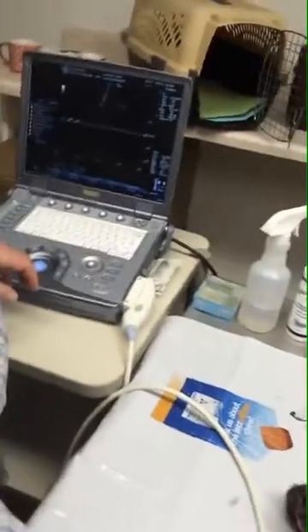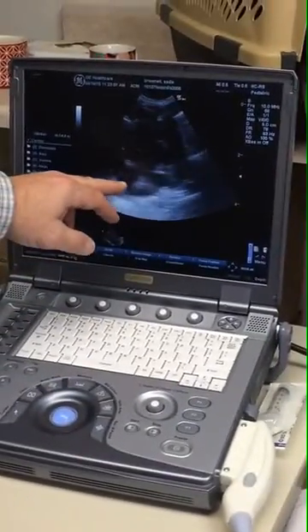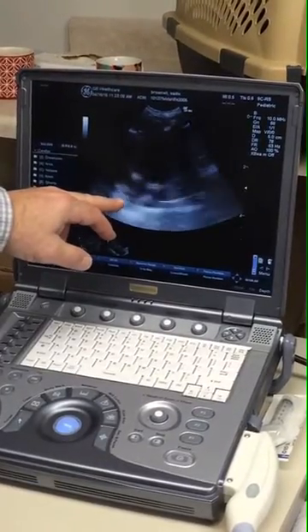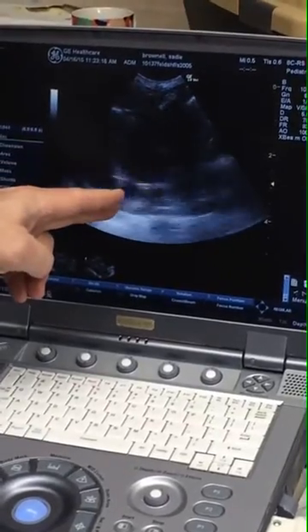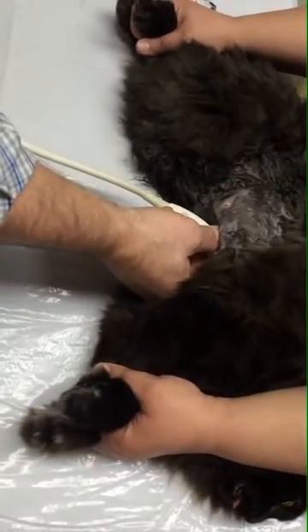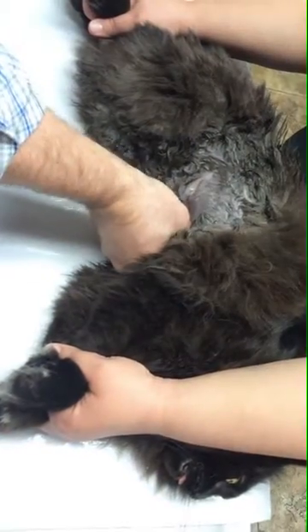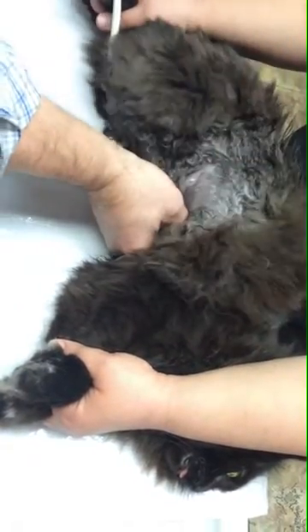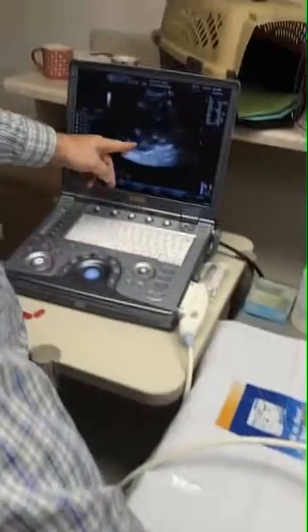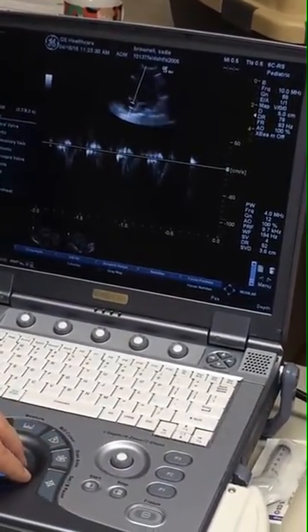When we do that, we find our little niche, we find a beating heart — that's a start — and we just do little tiny twists until that aorta comes in clean. You can see that as the sound waves come through, they're going to be lined up correctly with the aorta. If the probe is angled off, or if you're over on the sternum, the aorta will not be lined up. You have to be high on the chest, about a third of the way up, flat, and pointing towards the eyes of the patient. When you do that, the aorta will be lined up correctly and you can get a nice clean envelope.